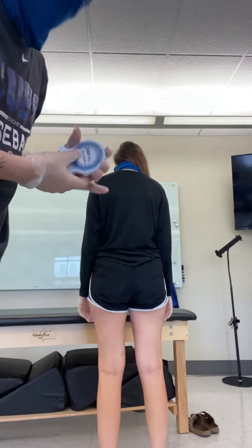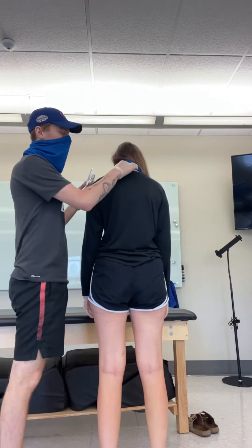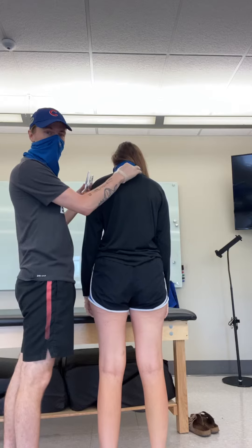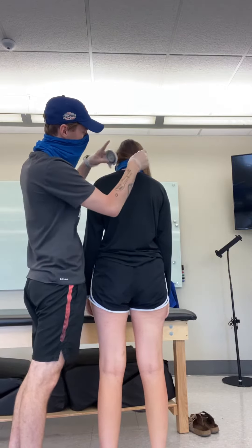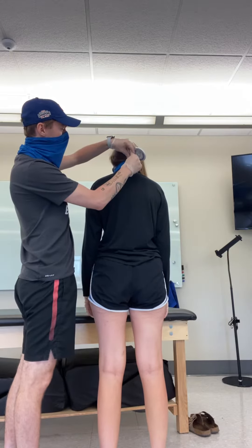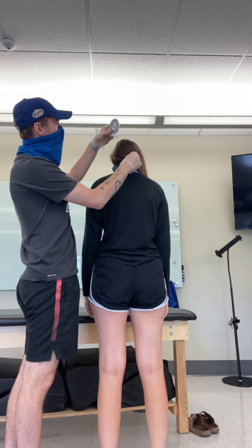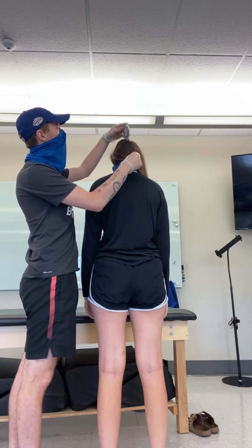We're doing the videos for the cervical spine inclinometer measurement, so we'll start with flexion. For the C-spine ones, you're going to try to find C7, which is going to be the first spinous process that you can feel. You're going to put the inclinometer over it and balance it out to zero. Then the other one, you're going to put on top of the head and get down to zero there.